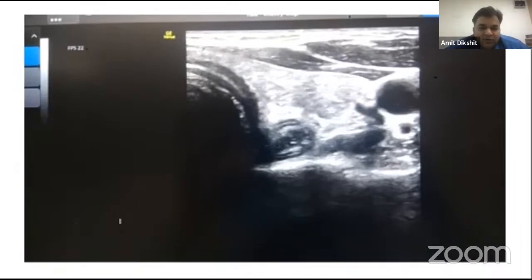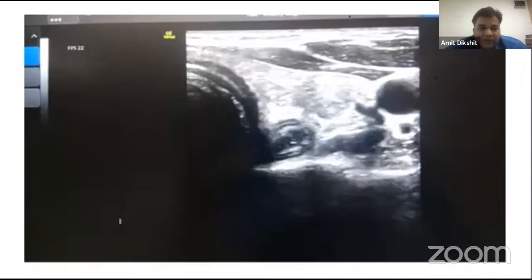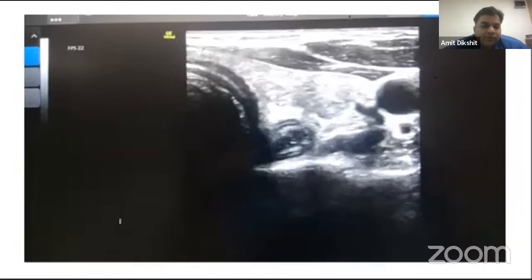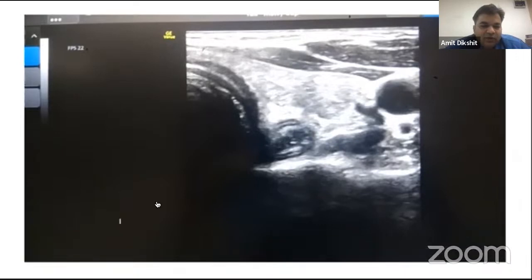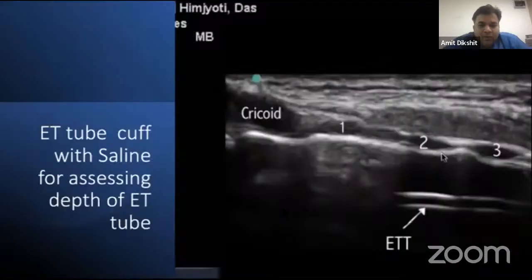So we always talk about regional anesthesia and interscalene block and laryngeal involvement if the drug sits here. That's the importance of this area for an anesthetist. When we see this esophagus very well, there is another question: where we should be providing the cricoid pressure. I think this has changed the way we look. Once we park the probe and see the esophagus, we may push the esophagus and try to occlude it at the time of rapid sequence induction. This is another insight. If you know where the anatomy is, rather than doing it blindly, it's a good idea to utilize this opportunity.